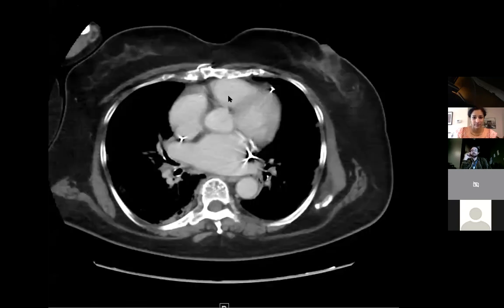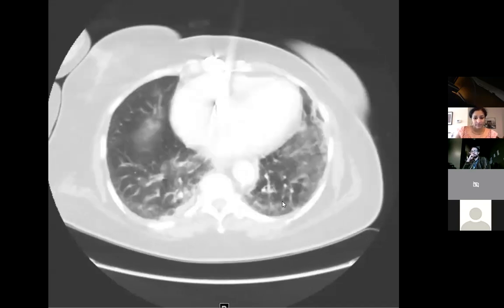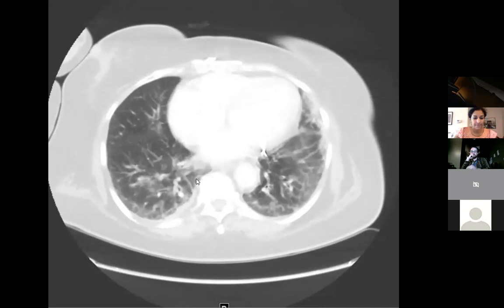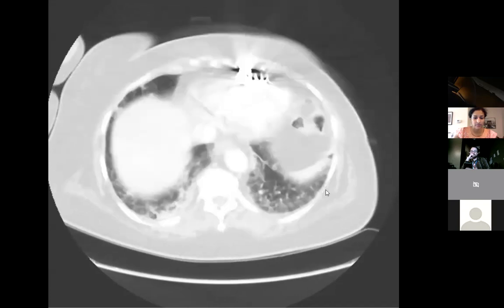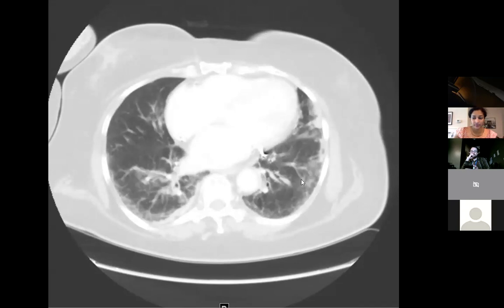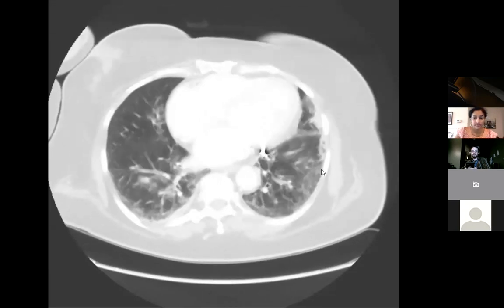There are no other findings, but when you look at the lung bases, the patient has these ground glass opacities. A lot of them are in a peripheral distribution. Now, if I was shown this case a year ago, even 5 months ago, this is a very non-specific pattern, of course, but in a situation where the prevalence of COVID is so high, this is pretty much COVID. Ground glass opacities, a lot of them peripheral. Classically, we also want to see some of them rounded, as you can see here. So the patient was tested and confirmed to have COVID.